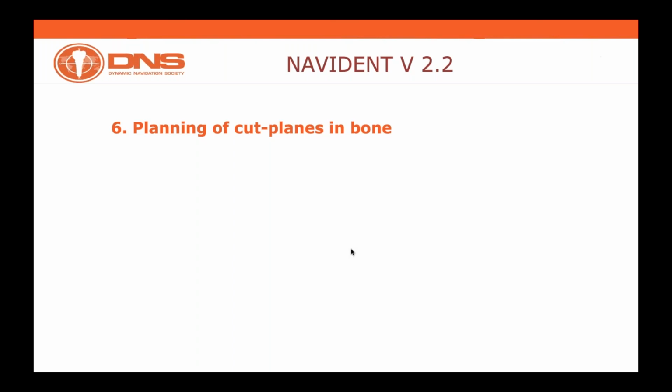We will usher in an opportunity which is dramatic in terms of simplification, of using mini screws, or using what we call a Navibite with screws, to allow the registration of a total edentulous patient. Again, those 2 items will be the object of a specific conference call in the future.